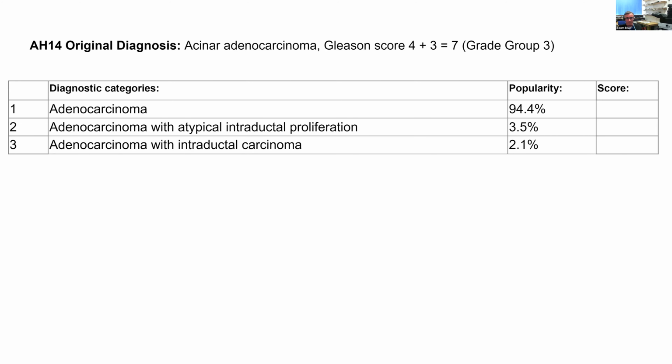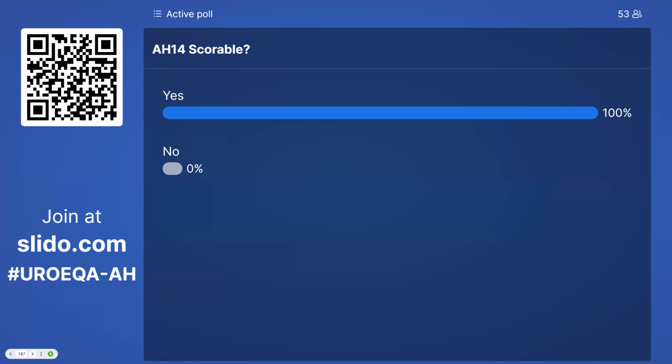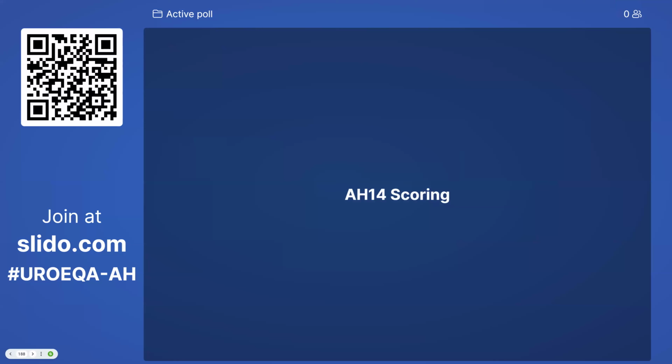Okay. So is it scoreable? I think the answer is yes. Is it? Yes, I think I would have thought so. Hopefully people will agree.